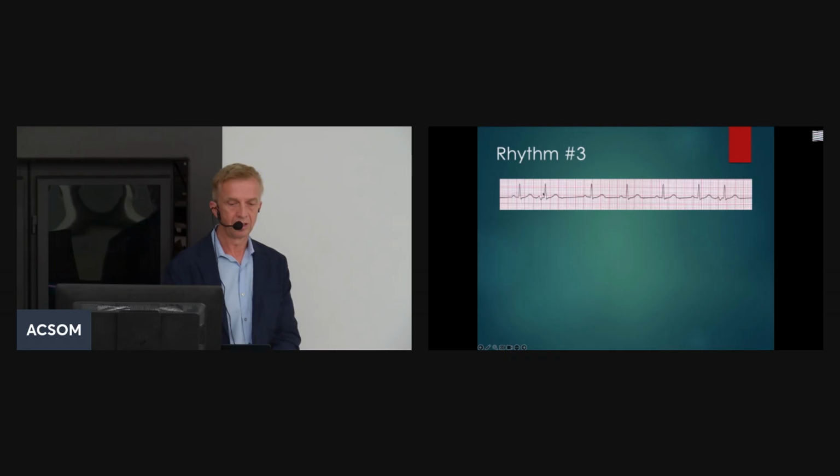It originates in the atrial tissue, so it starts earlier than the normal sinus beat, and these are the normal sinus beats. You can also see the morphology of the P wave is different compared to the sinus P wave. It's biphasic: the first portion goes up and the second portion goes down. So it's a biphasic P wave.